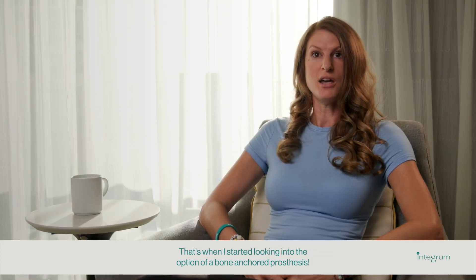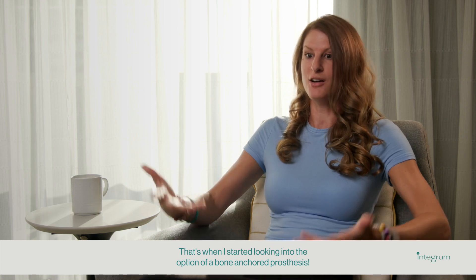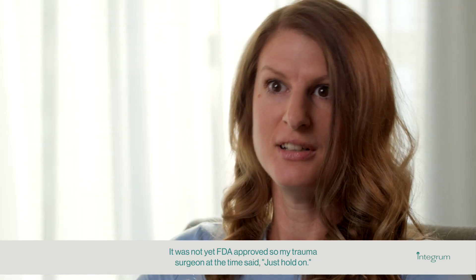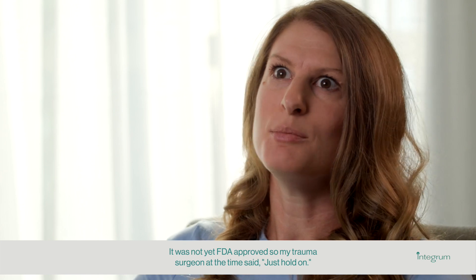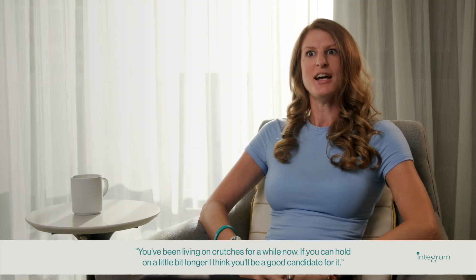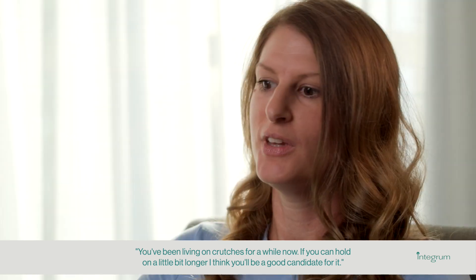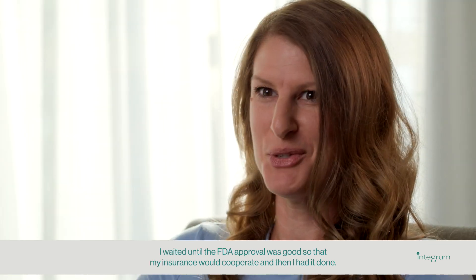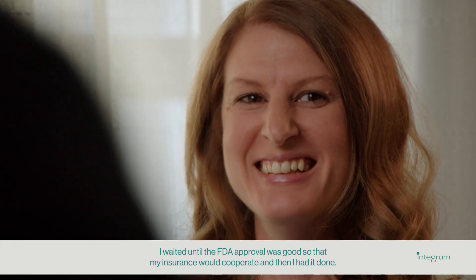That's when I started looking into the option of a bone-anchored prosthesis. It was not yet FDA-approved, so my trauma surgeon said just hold on — you've been living on crutches for a while, and if you can hold on a little bit longer, I think you'll be a good candidate for it. I waited until the FDA approval came through so that my insurance would cooperate, and then I had it done. Started the process in October 2021, and now I'm here.